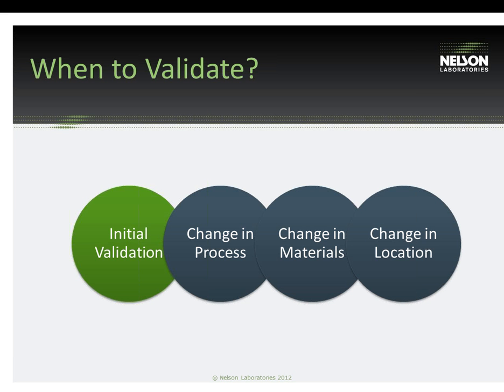And so because they saw a spike from this continual monitoring after a change was made, they were able to go back to their process. They added a water rinse after the IPA rinse and were able to flush out those residues left behind, and they were able to get their levels back down to an acceptable level of cleanliness. And so it's really important to note, if you've made a change in your process, to reevaluate things to make sure that there are no other contaminants that could be introduced that could be harmful on your device.